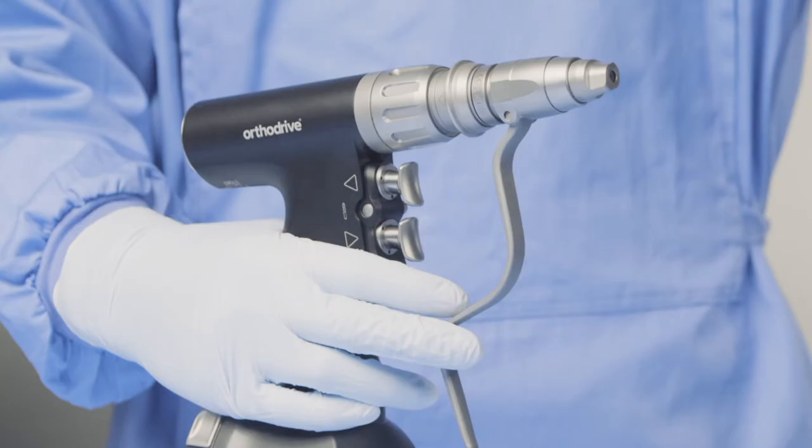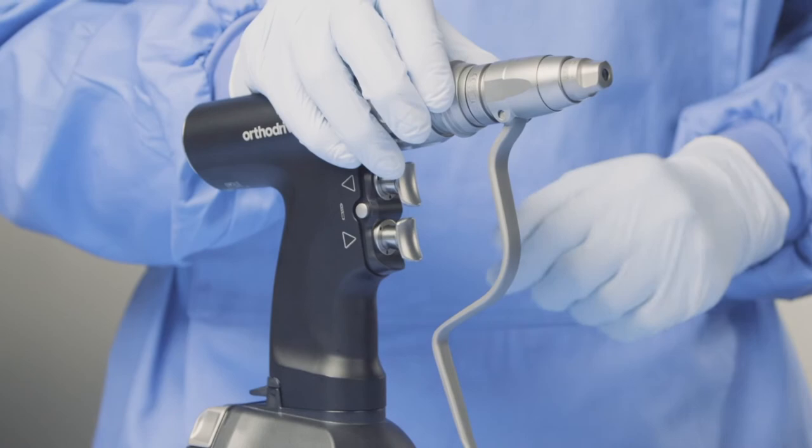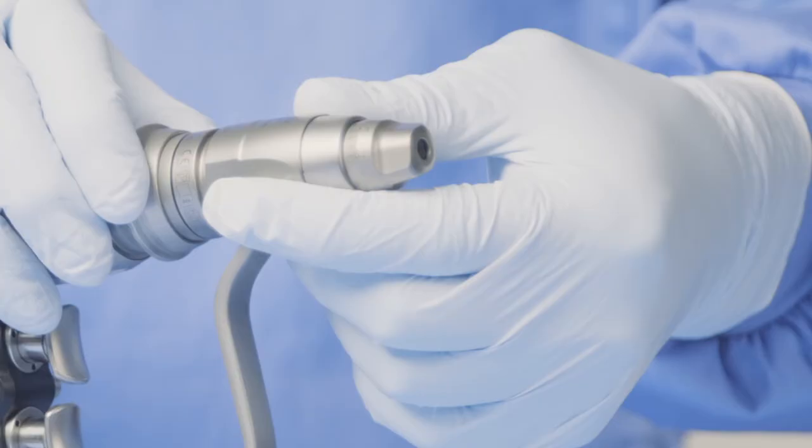To remove the attachment, place the tool back into safe mode, pull back on the collar, and turn 45 degrees anti-clockwise before sliding straight out.